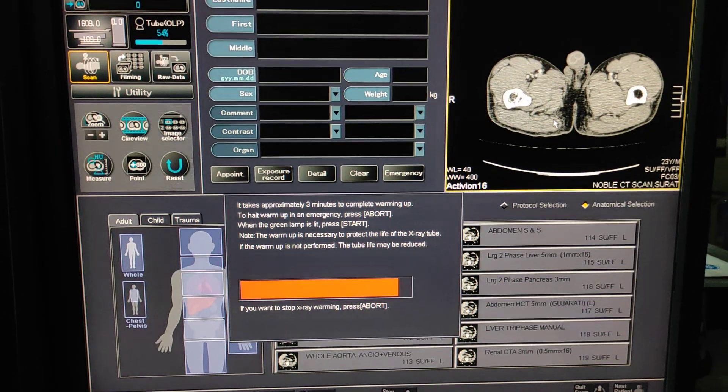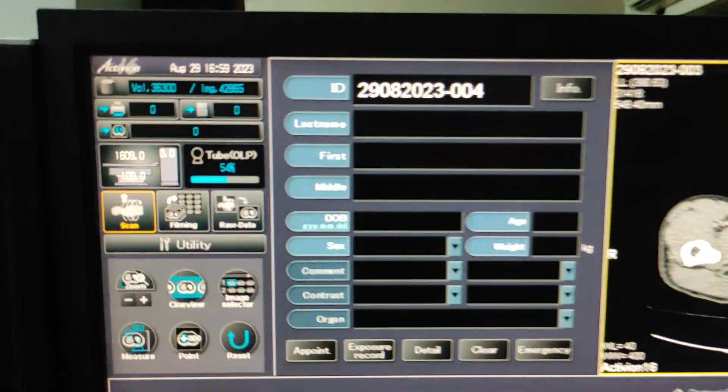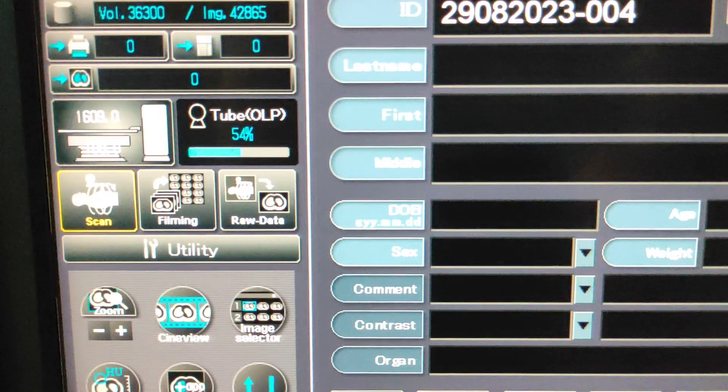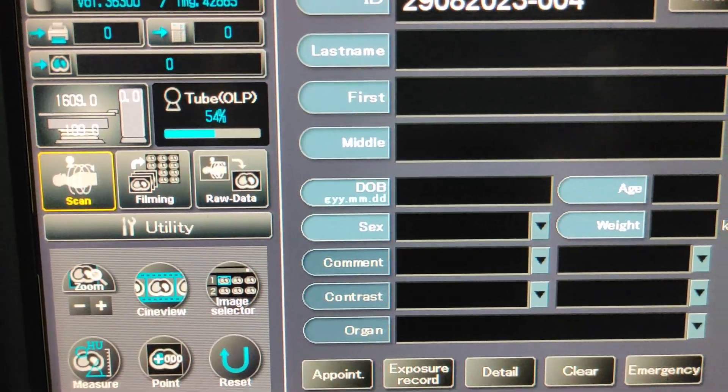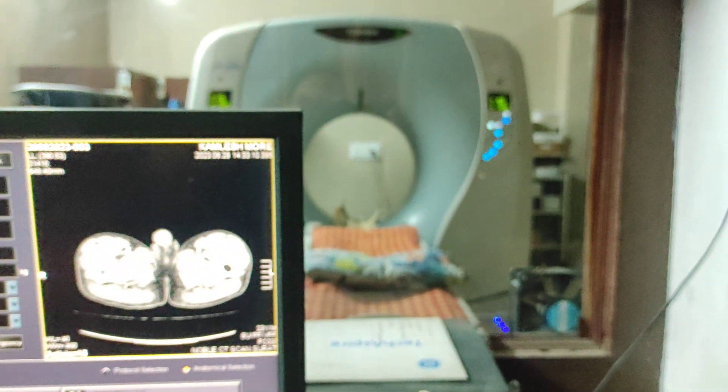This is the routine process every morning whenever you are starting the system. Now check the tube OLP — the tube OLP is now at 54%. You can now start your scanning process.